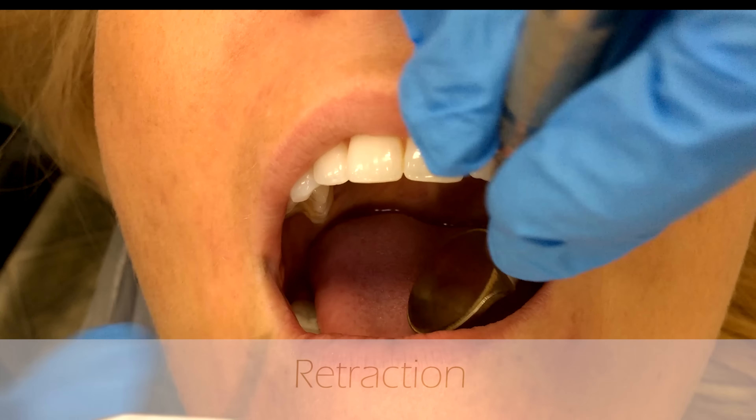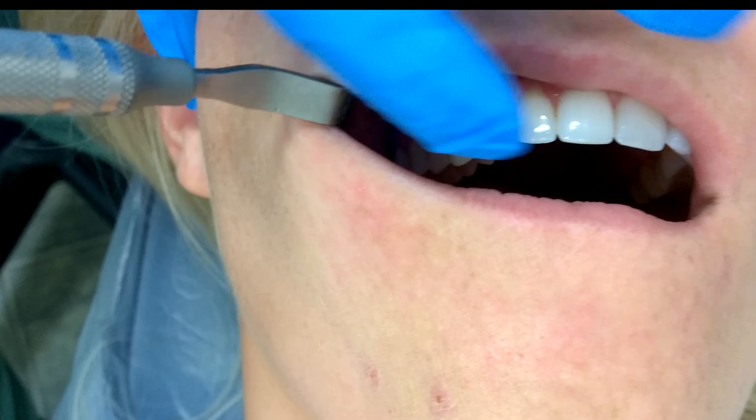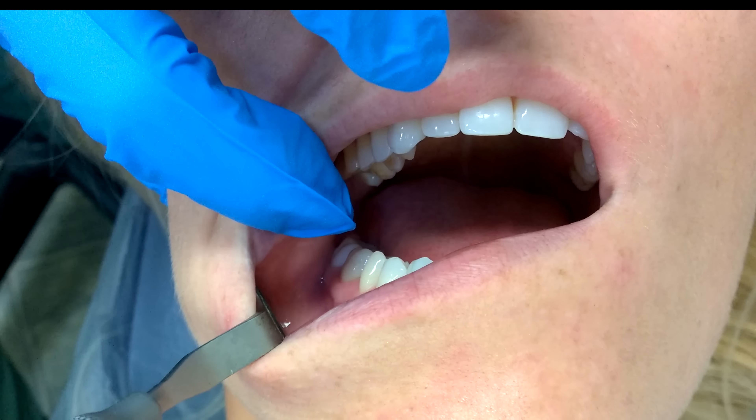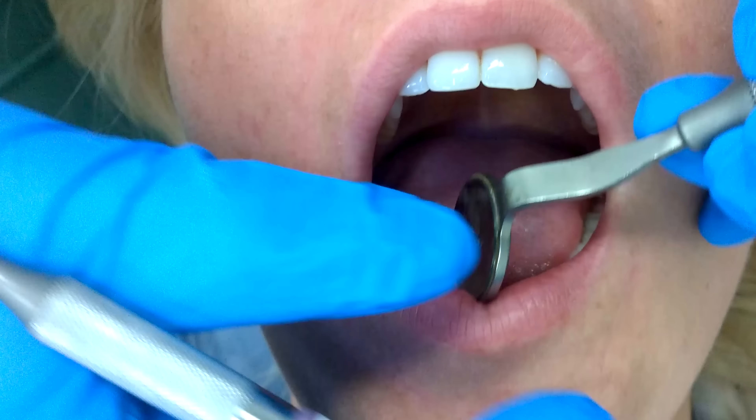Number two is retraction of the lips and tongue. As you pull up here you can see quad one, and then you can gently slide it down to see the buccal of quad four. Make sure that you're very cautious when you enter into the mouth so as not to hit any of the teeth with the mirror.